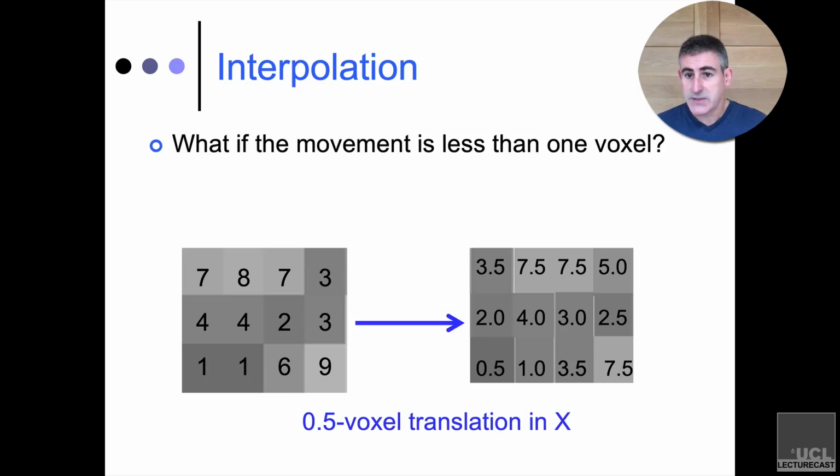But what you can see is you still have this edge effect on the left side here, where the first voxel's value is 3.5, because I've averaged 0, which is data that I didn't collect, with the data that I have, the 7. And nonetheless, I get this kind of darker edge on the left that is an edge effect due to the realignment. Realignment always produces edge effects.